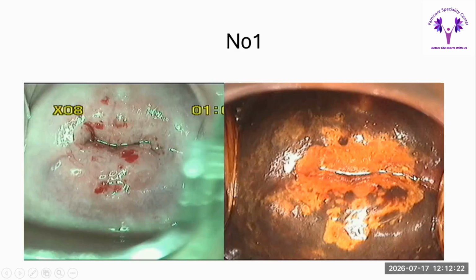But as per the guidelines, now they are saying that you should biopsy the areas also in such cases where acetic acid whiteness is visible, and Lugol's iodine is not considered to be very sensitive, but because CIN2 and CIN3 are heterogeneous, they're asking us to take multiple biopsies. One could take the biopsy from this particular area.